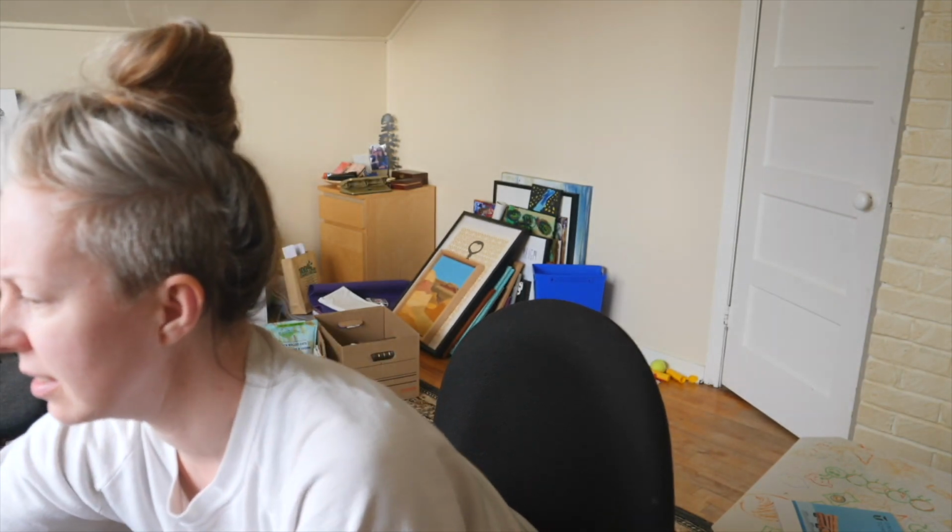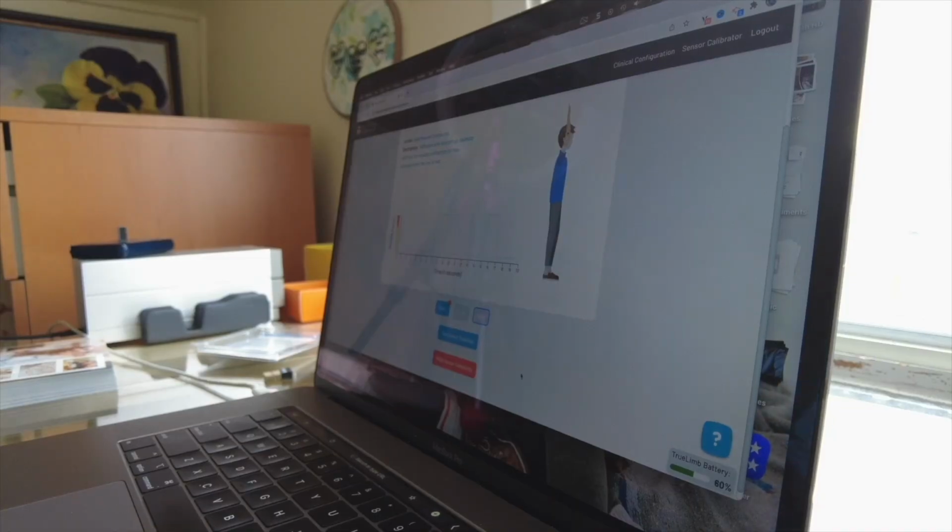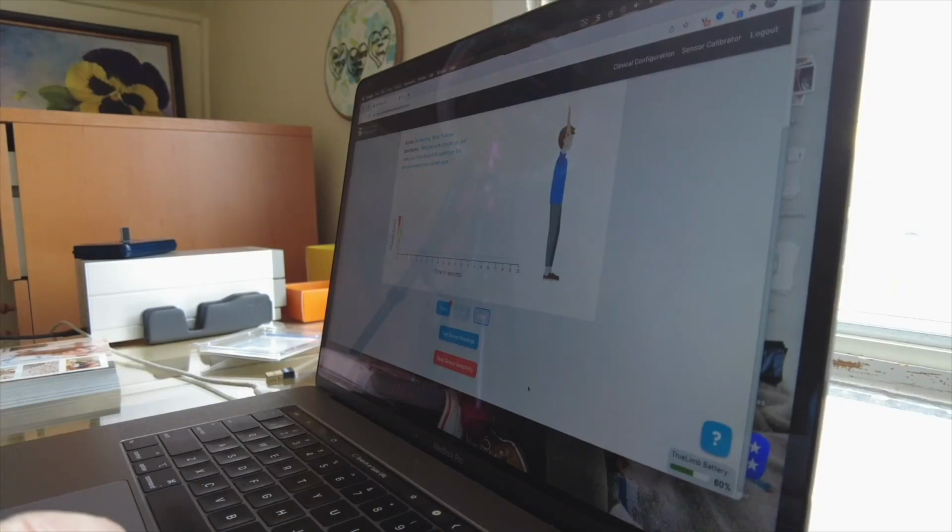Okay, next. Okay, so with your arms straight up, squeeze and hold the muscle contraction for 2 seconds when the line is red. Okay, I can do that. The arms straight up! Thank you. Okay, with your arms straight up, just relax your muscles and do nothing. No problem. Here we go.